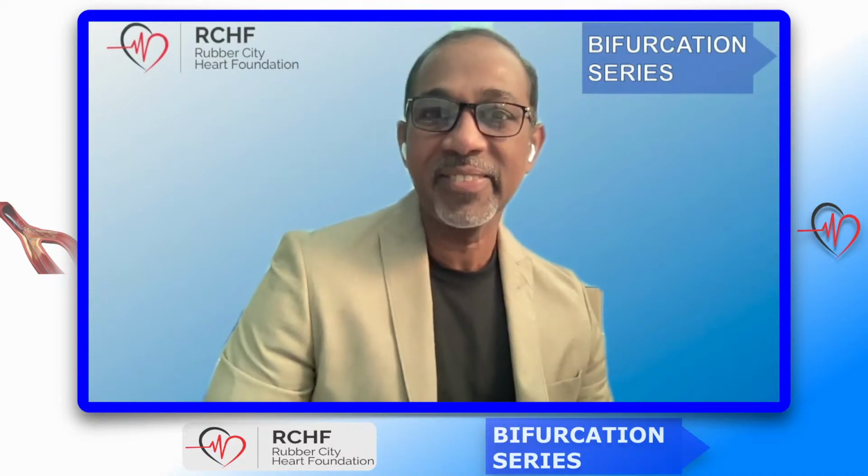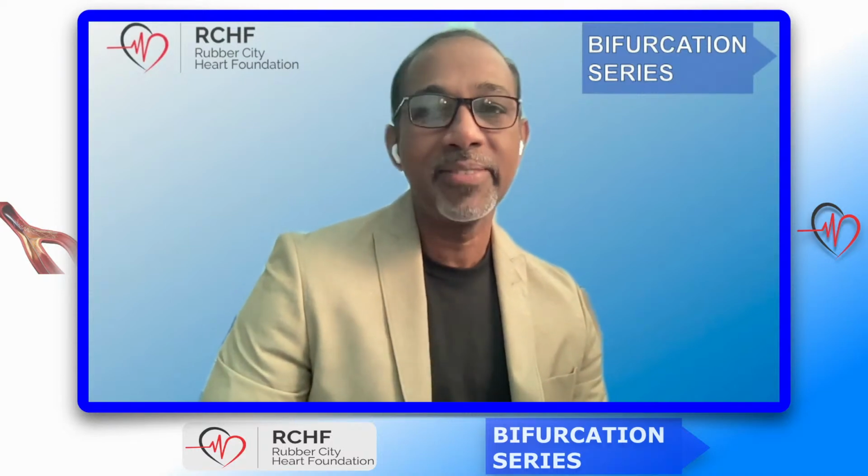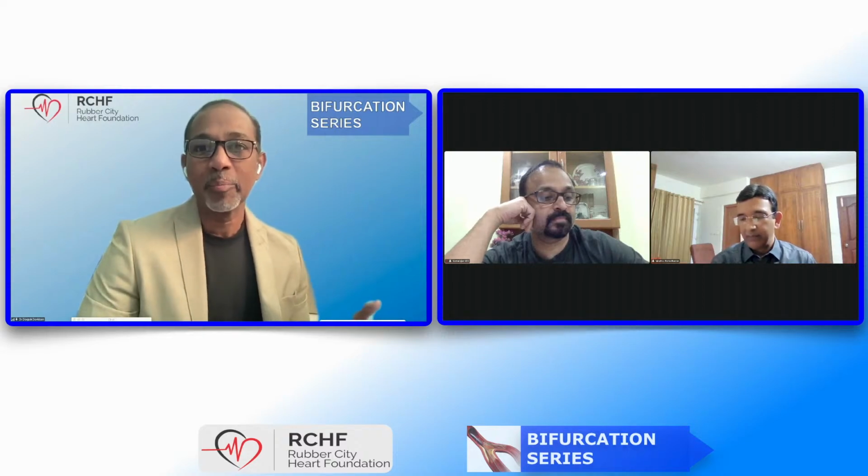Then the second session, we have Dr. Goran giving the keynote lecture on tips and tricks in Culotte technique. And finally, the last session, we have 3 difficult cases, that is 3 Culotte cases wherein we had challenges, being presented by very senior interventional cardiologists.